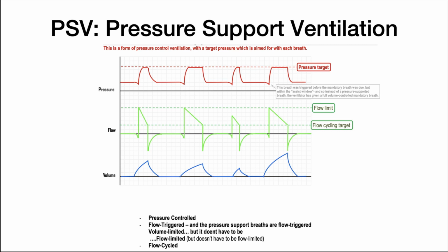Whilst it's unlikely to be used in the pre-hospital setting, pressure support ventilation is used for patients who are awake enough to accomplish spontaneous breathing. PSV was initially developed to reduce the work of breathing in SIMV, but evolved into a standalone mode of ventilation. Pressure support ventilation augments a patient's spontaneous respiratory efforts with a selected level of peak airway pressure. The inspiratory pressure is delivered until the flow decreases to a predetermined level, usually about 25% of the peak flow. PSV allows the user to control the desired pressure support, PEEP and FiO2. This mode relies entirely on spontaneous breaths by the patient, who must have an intact ventilatory drive.